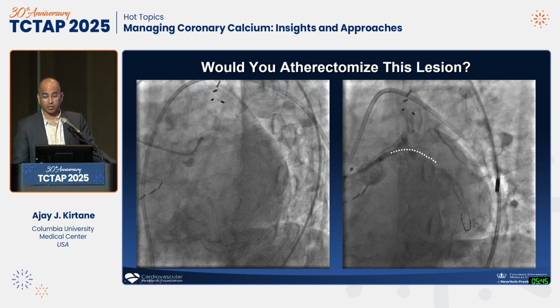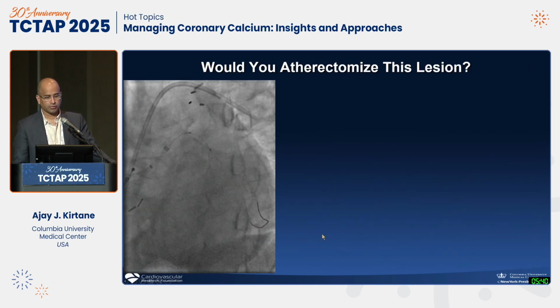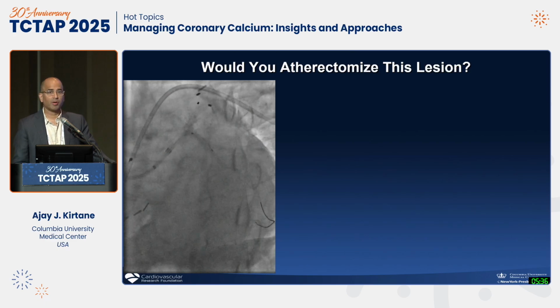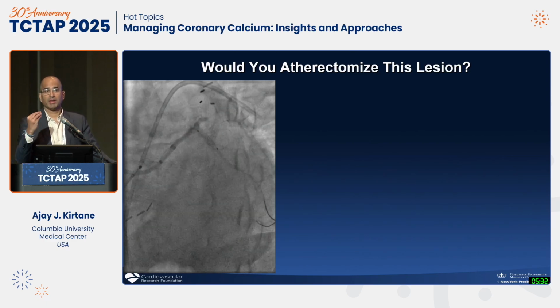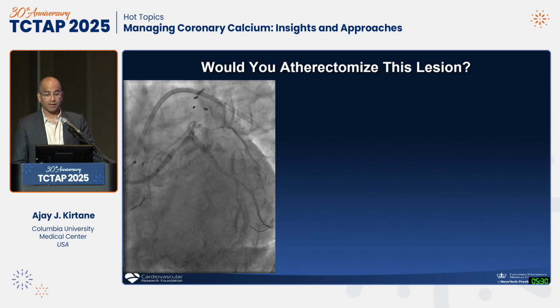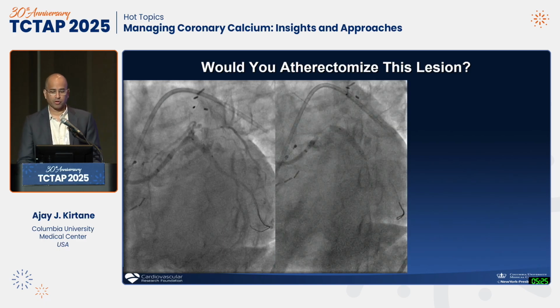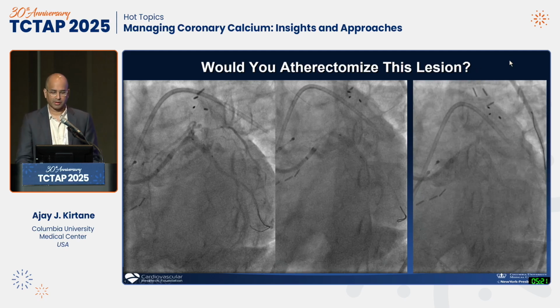Everybody's shaking their head no, but in fact, it was done. Somebody did atherectomy in this case, and sure enough, what you see is a nice big perforation that happens as a result. Very predictable, but the point is if you don't have the experience, you may make this mistake, which is why I'm showing the case. Thankfully, this was actually solved by covered stent, which somehow at that time with the Joe-Med delivered, and the patient's doing very well. He's 90 plus years old and is my clinic patient.